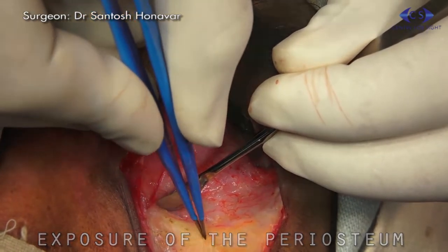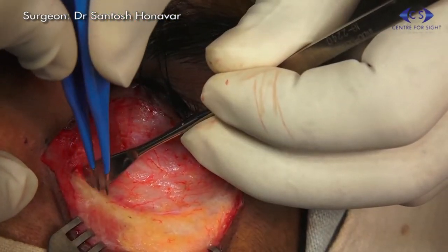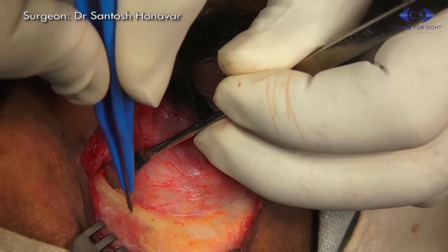Dissection is done until the orbital rim is reached and the periosteum just outside the arcus marginalis is incised.